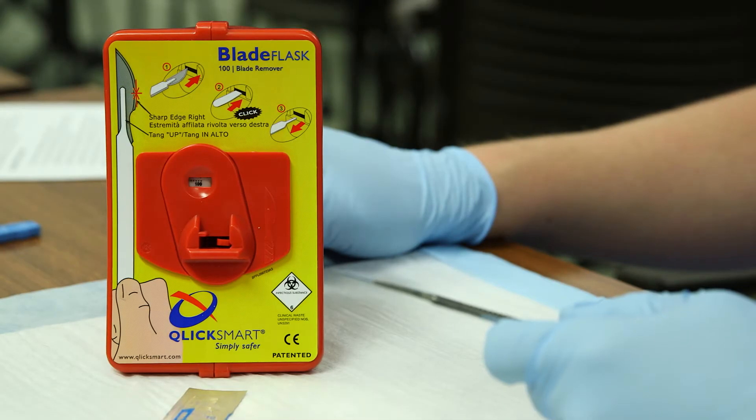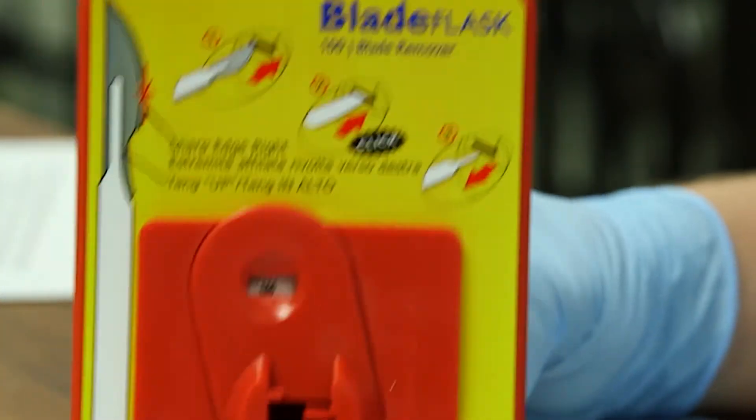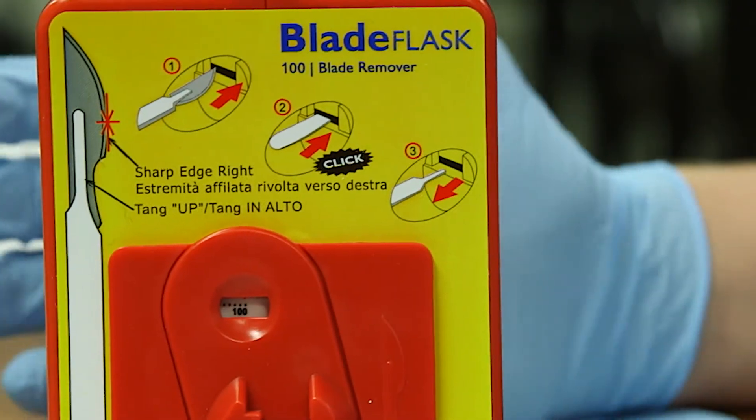Removing the blade. Ideally, the best way to avoid injuries from removing a scalpel blade is to use a removal device like a blade flask. It works as a sharps container.